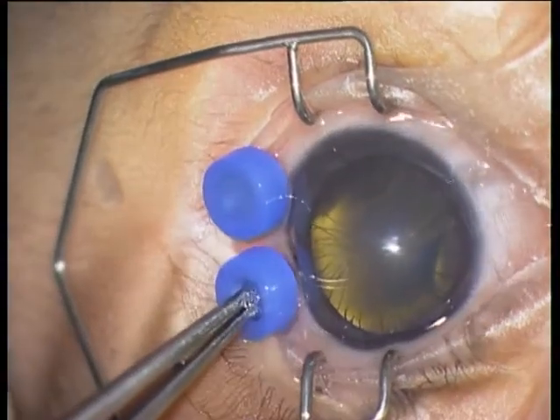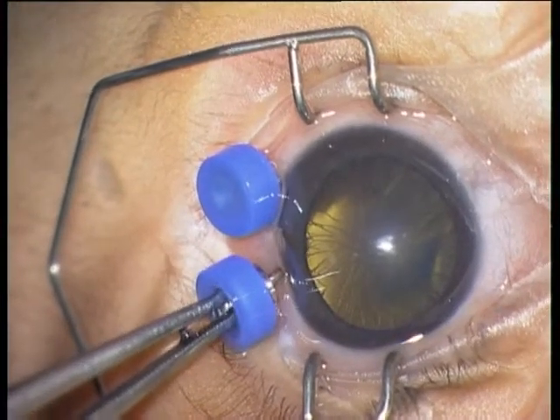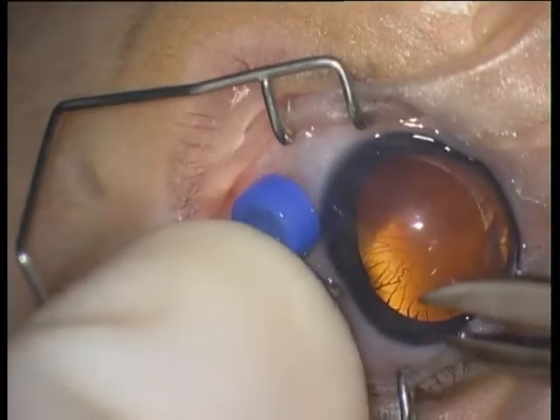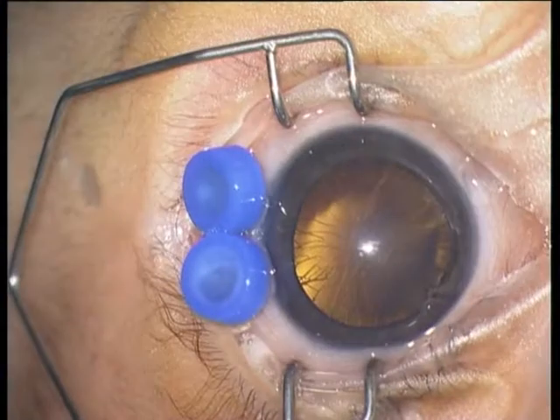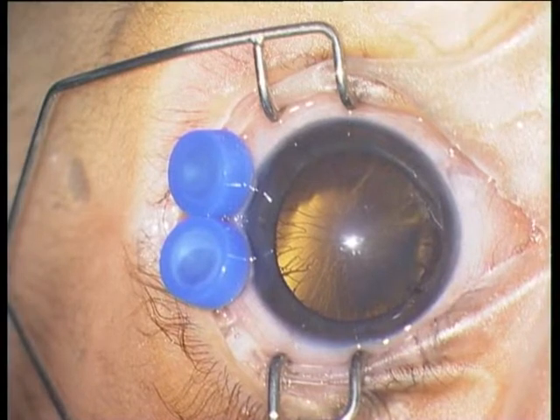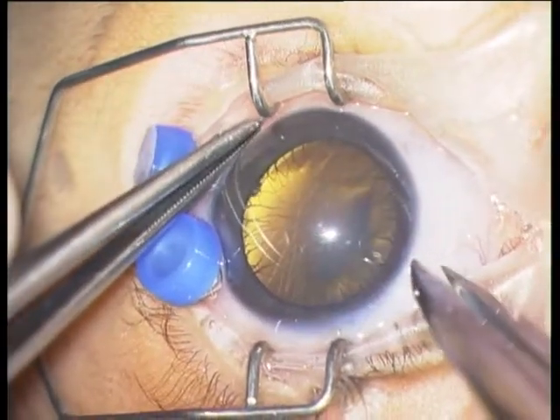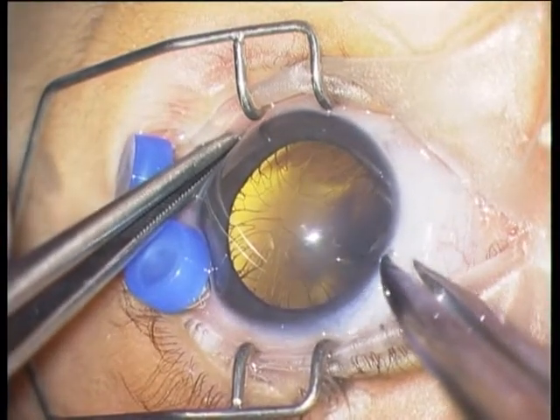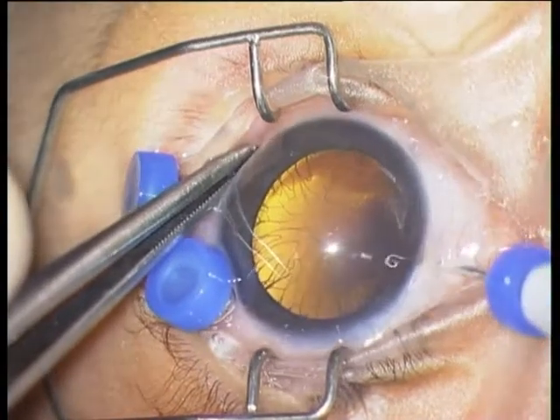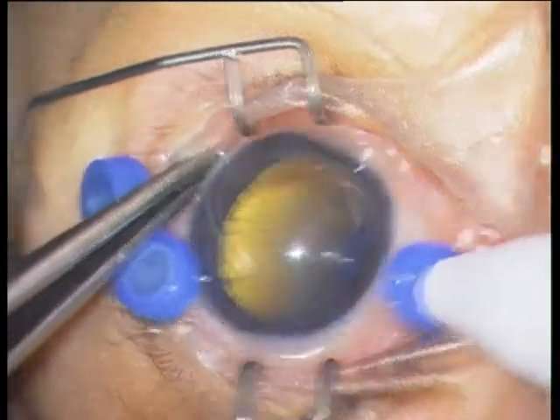I do not suture the sclerotomies. On the next step, at follow-up, the globe was completely normotensive and the conjunctiva was white — so there was no hypotony. With this perpendicular sclerotomy approach, the surgery I will perform is a central and peripheral vitrectomy.